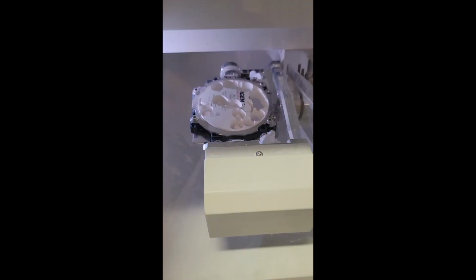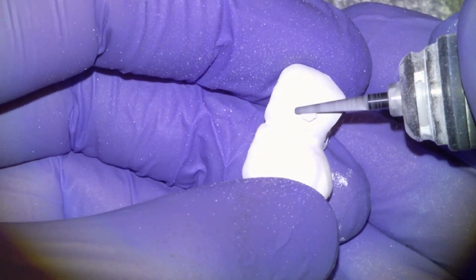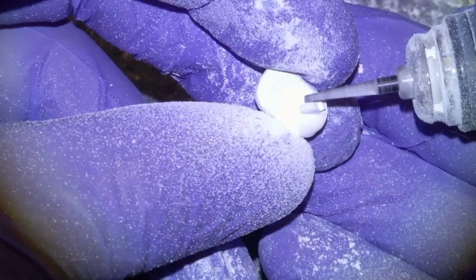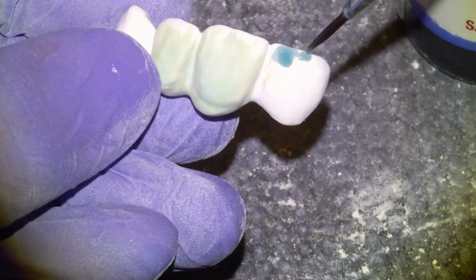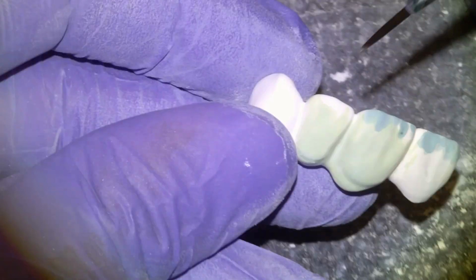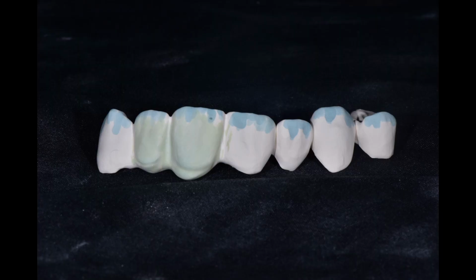Once the milling is complete, we're going to take out the disc and inspect the parts. Going to cut them out and then de-sprue, smooth off the sprues with this lab hand piece here. All the parts, and then once the green state parts are free, I actually like to put a stain on them. This is called a pontic reducer that makes the pontics have the same color character as the retainer teeth. And then I'll put on some of this incisal effect to the incisal edges, which makes them look a little bit more translucent. And then here's our parts ready to be sintered.